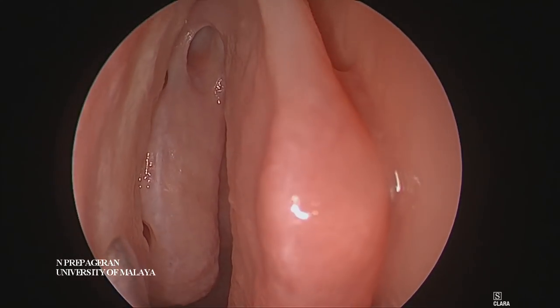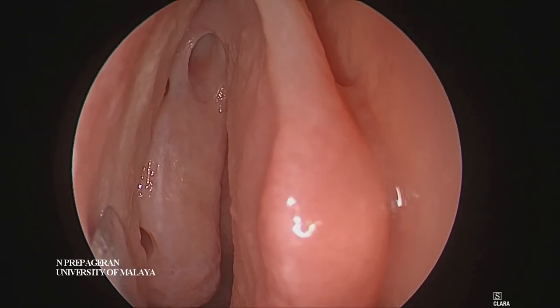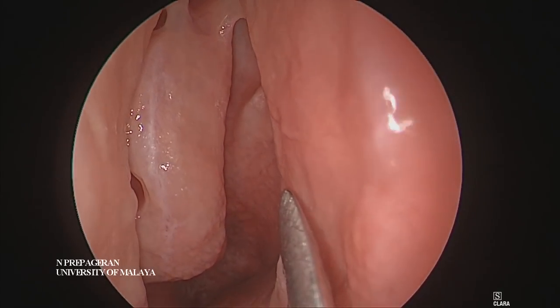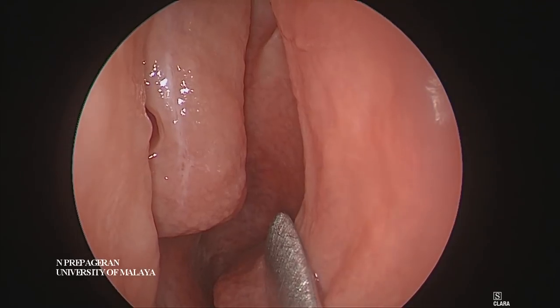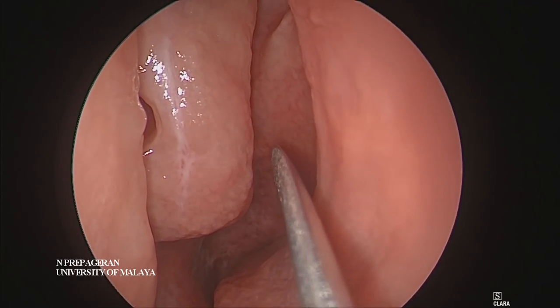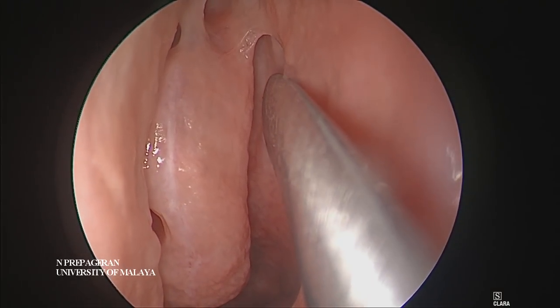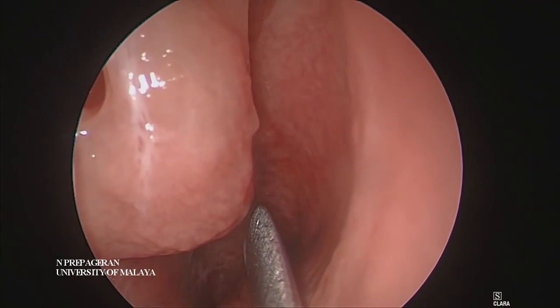So if you go inside, you can see this is the uncinate process, which is gate number one. And this is the bulla, gate number two. And if you push the middle turbinate gently to one side, you can see how the middle turbinate curves laterally. And this curvature forms the ground lamella, which also forms the third wall. You can see the vertical aspect and the horizontal aspect of the third gate as well.